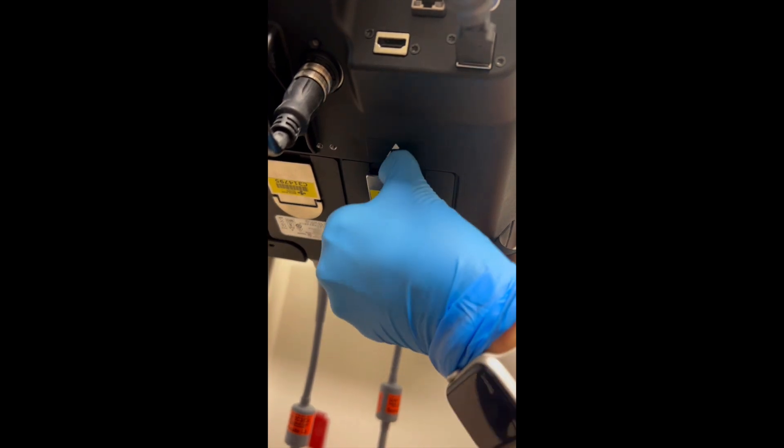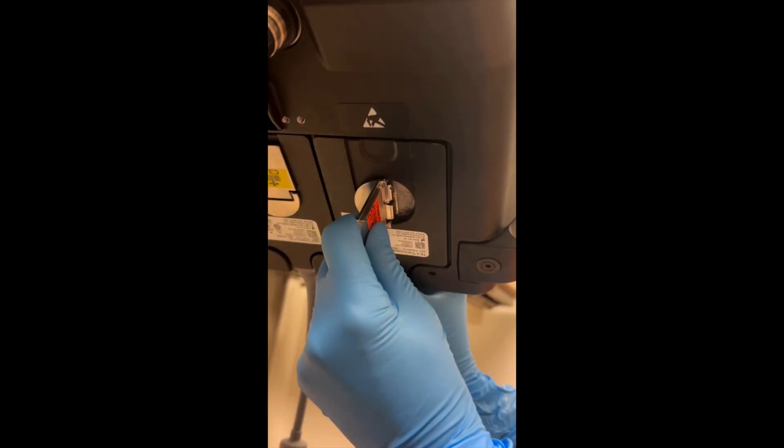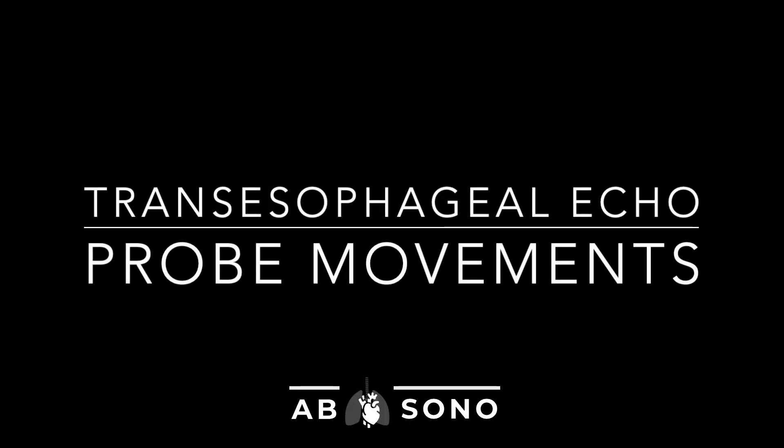While every machine is slightly different, in general you will need to remove one of the probes already attached and replace it with the transesophageal probe. Next, we will explain the basic movements of transesophageal echo.